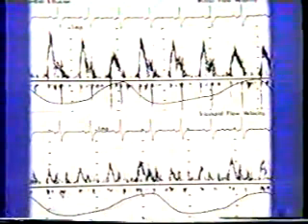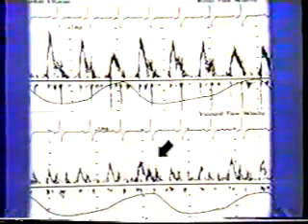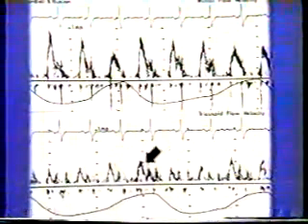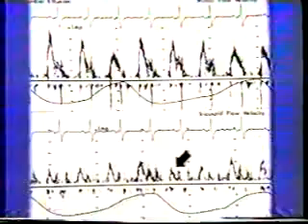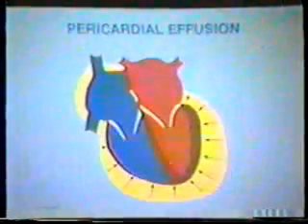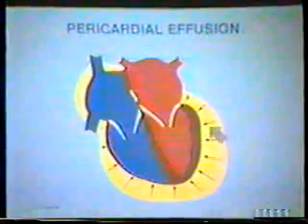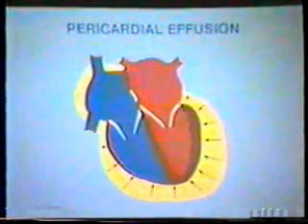These are mitral and tricuspid velocity profiles from a patient with tamponade. You will notice that the changes in tricuspid velocity with respiration are reciprocal to the changes in mitral velocity. With inspiration, there is an increase in tricuspid velocity, while the first beat of expiration shows a significant decrease in tricuspid velocity. These reciprocal changes are likely due to the phenomenon of ventricular interdependence. With tamponade, the elevated pressure in the pericardial sac, which surrounds the heart, maintains a constant total cardiac volume.